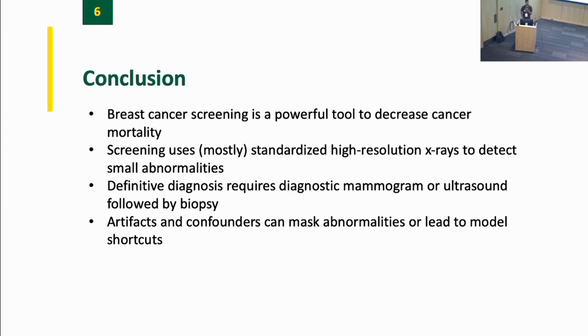Beyond that, MRI is more uncomfortable. There are more contraindications to MRI of women that can get MRI. And then lastly, it's also extremely expensive, right? I don't know the exact number, but if I had to guess, probably 10 times as much or maybe 20 times as much as a mammogram. So it's just not feasible for those reasons. Great question.